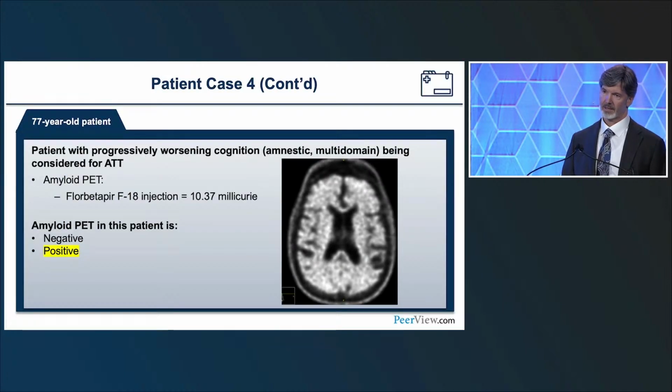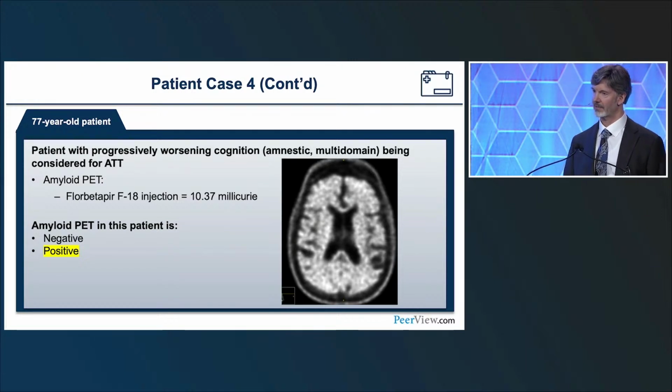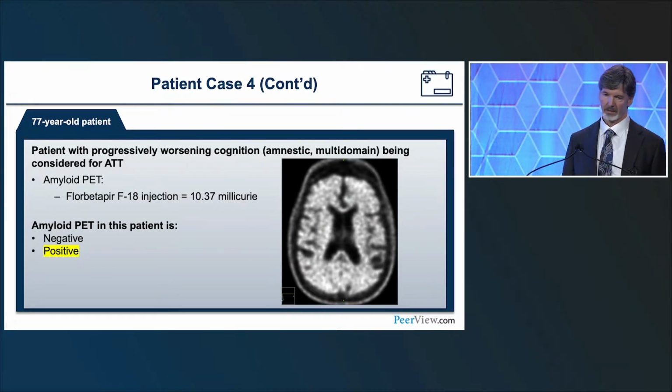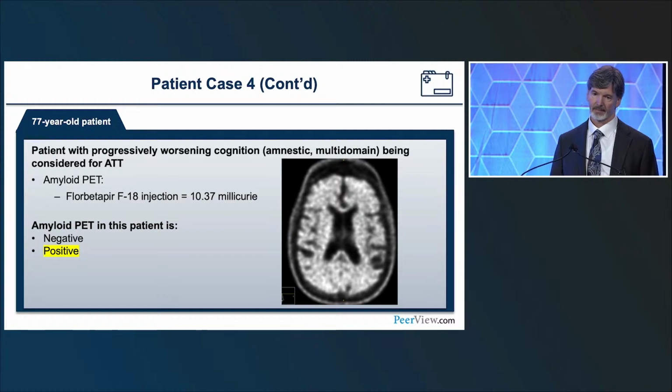You're right, it's positive. Now, why is this a little bit of a challenge? Because of the CSF dynamics, you see some areas that maybe someone could confuse with areas that are not just filling all the gray matter. Some areas that people point to that should be maybe more full, they aren't because of this person's CSF dynamics issue. So slightly confusing, but not a huge reason to call this negative. There's lots of areas that are filling out nicely right to the gray matter ribbon.